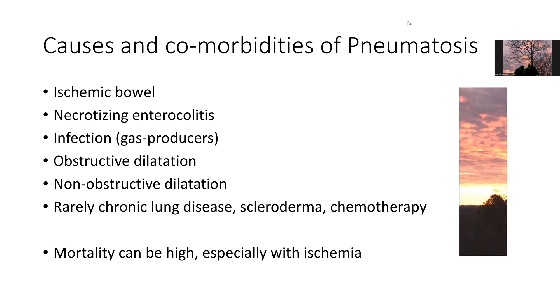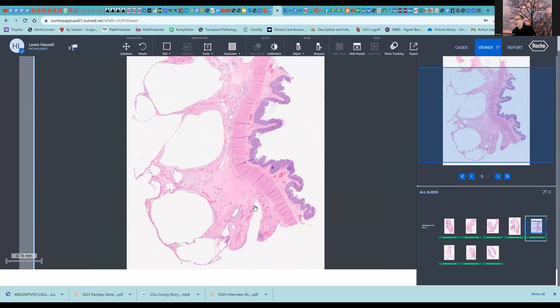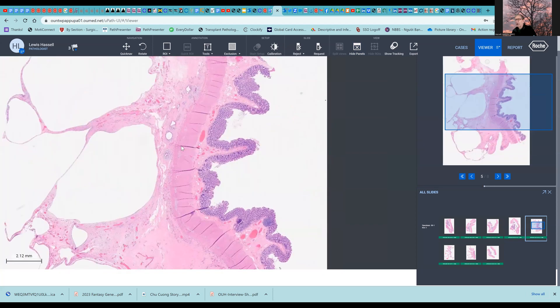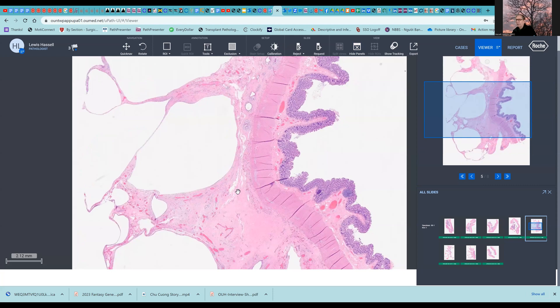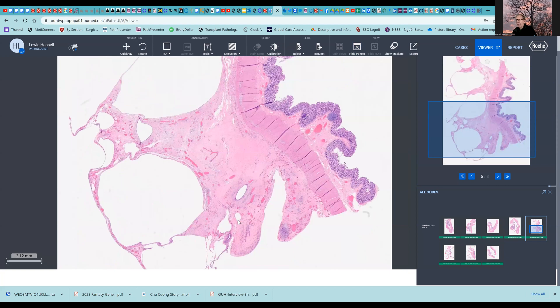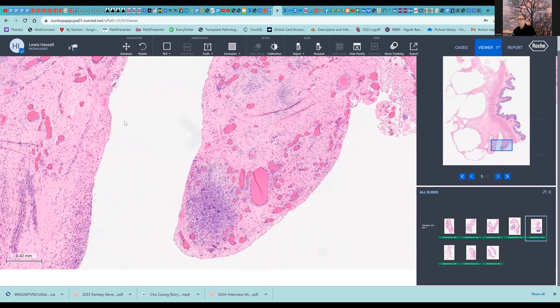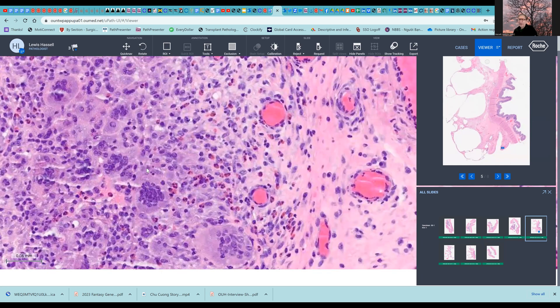So let's take a look at what we found under the microscope. Here's a representative section of the bowel — a portion of transverse colon that we received. As you can see, the mucosa looks quite unremarkable, and in fact the mucosal surfaces were entirely unremarkable with no evidence of ischemic changes. But the pericolic tissues showed massive dilated spaces, very thin-walled. A few of them had little foci of inflammation, and particularly of note is the presence of giant cells, which is a fairly characteristic feature of this entity, with some associated neutrophils, eosinophils, and other inflammatory cells.